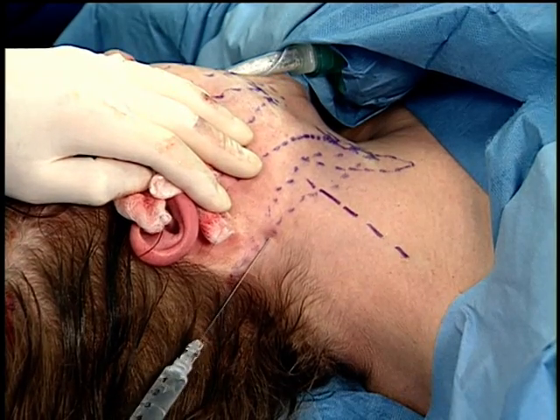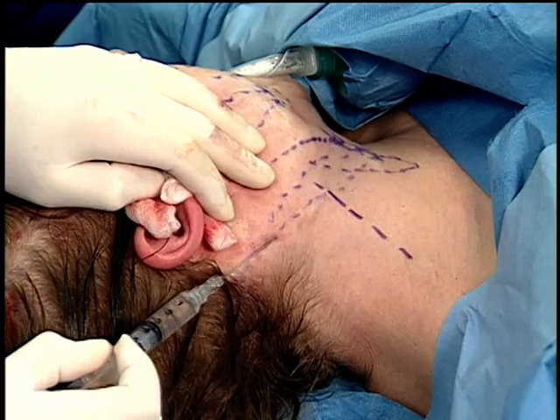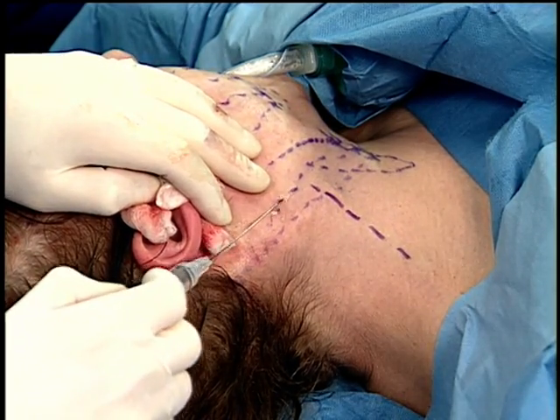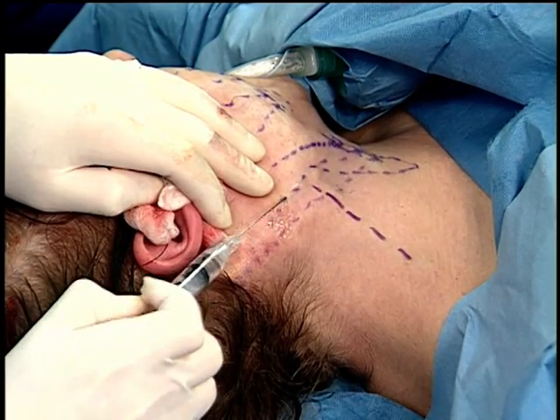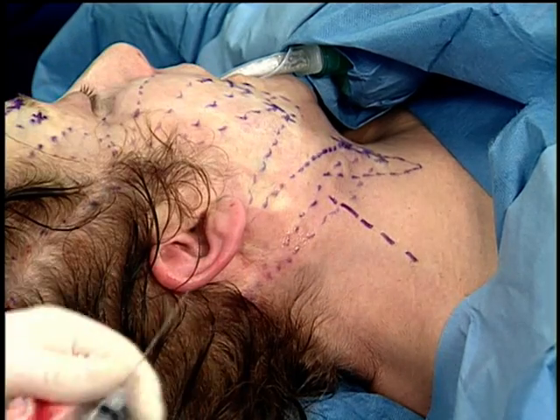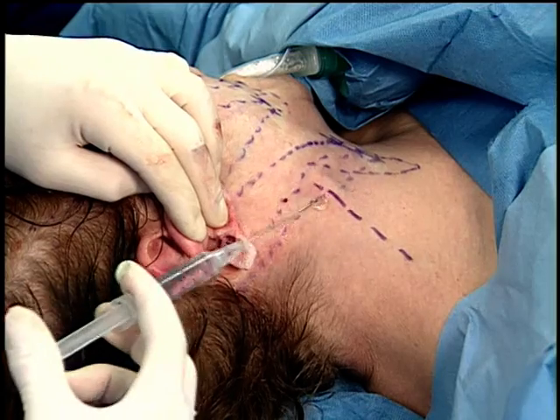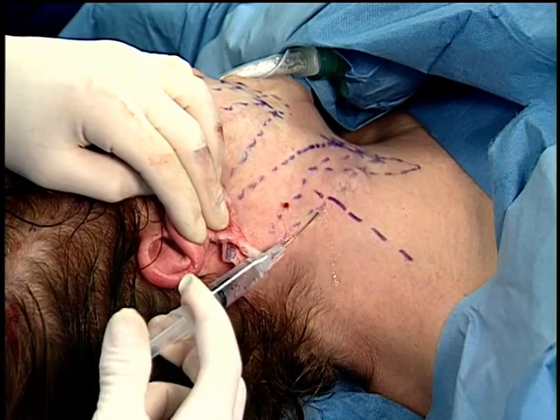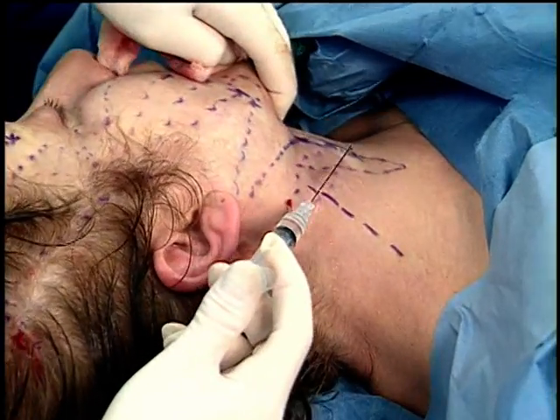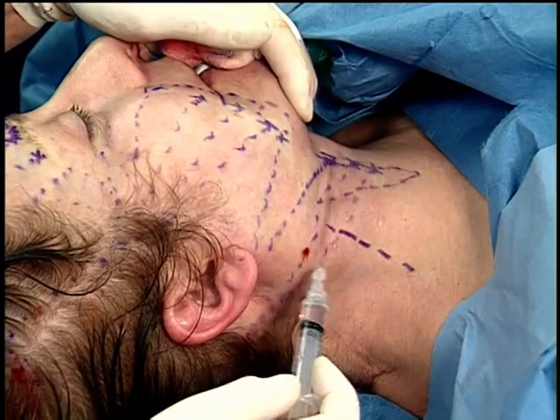So make sure you lift off that really adherent skin over sternocleidomastoid. Come over external jugular and push that down. Push that down deeply so you pass above it. Not a disaster if you go into it, you get more ecchymosis, but it won't compromise venous drainage to the neck at all. It's a superficial vein, and there are lots of deep venous structures that drain the neck adequately. And again, get in the right space above platysma and get your hydrodissection plane right out to that lateral tracheal groove where you'll be exiting for your thread lift of the neck.